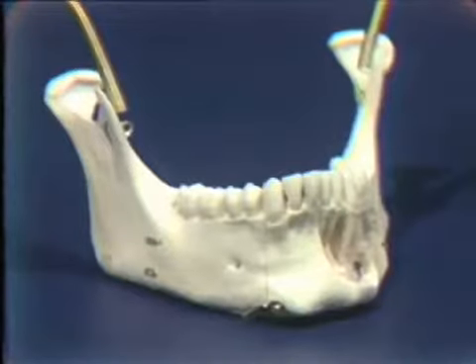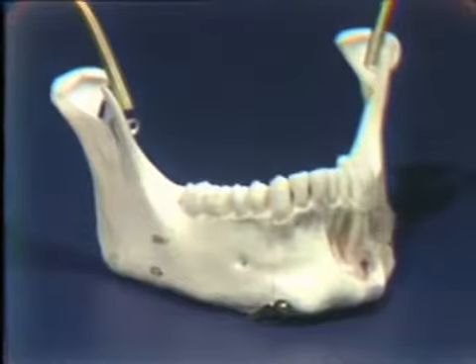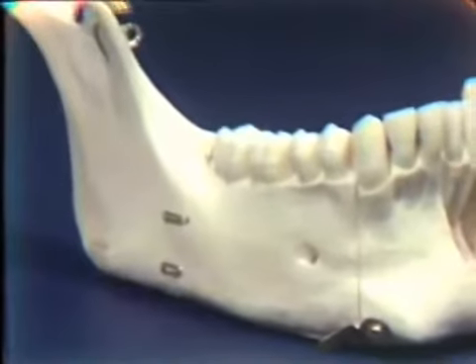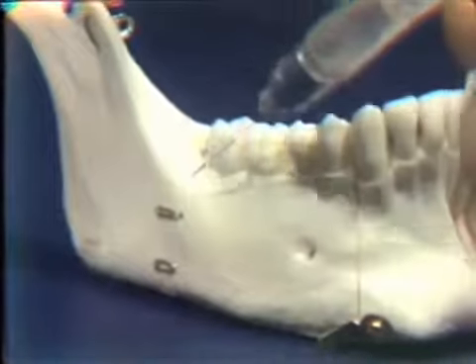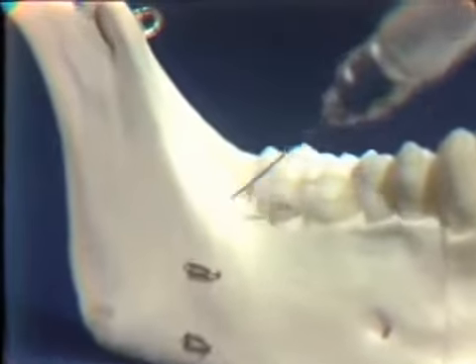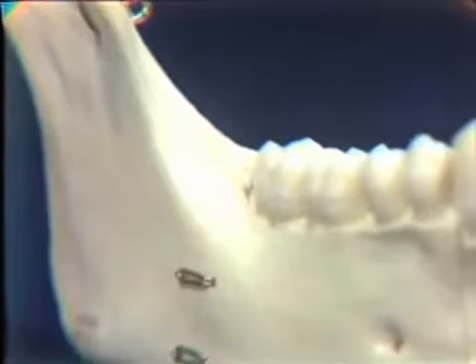Let me just demonstrate briefly here on the mandible approximately where we would inject to give the long buccal injection. With the mandible closed slightly, or approximately halfway, we would retract the cheek and put a little tension on it so that the vestibular tissues are tense. They are taut. And our injection site would be approximately at the distal aspect of the second molar. Now, many times it is not necessary that the needle bevel be against bone for this injection, since these nerve fibers are very close below the surface of the mucosa.